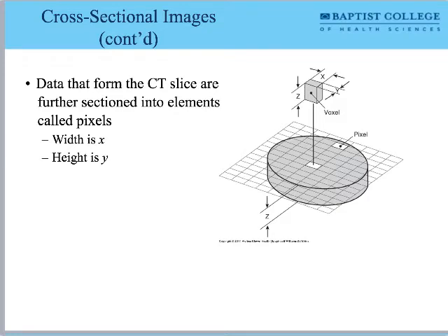As I'm moving right to left along the x-axis, I'm doing just the same with the patient, only this is the way a doctor once explained it to me. Imagine you're looking up the patient's skirt. I don't know, it's stuck in my mind. You're seeing the pictures flipped. So for us as X-ray techs, we're comfortable with that.